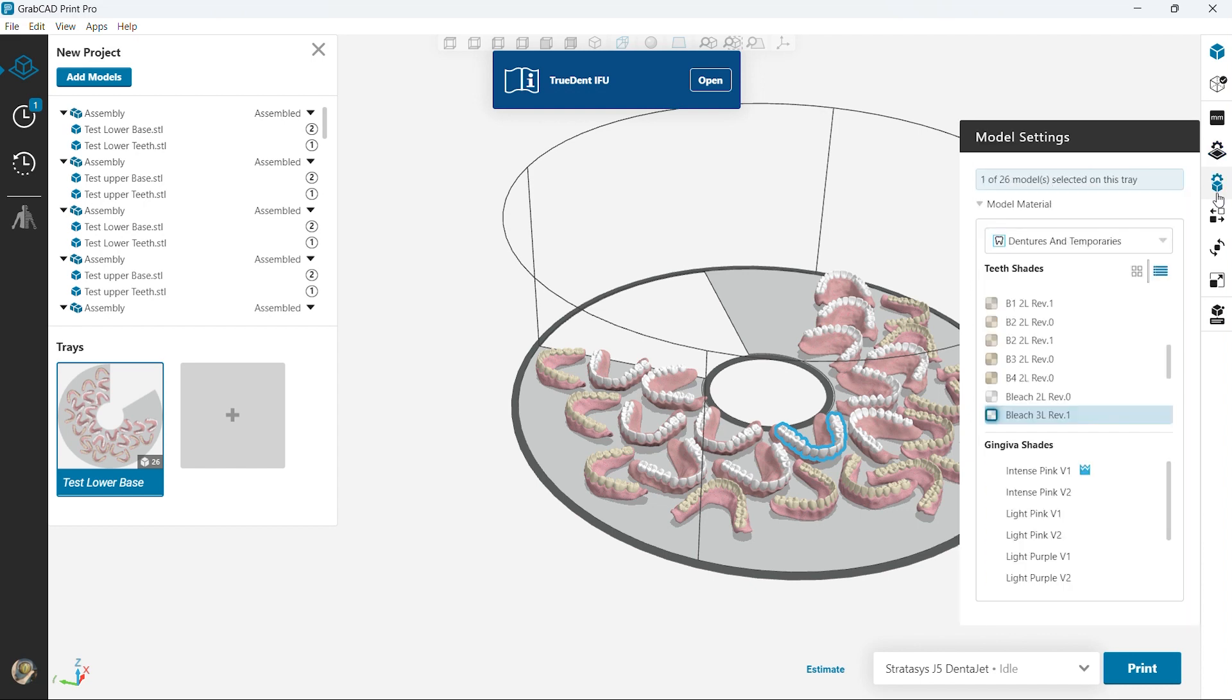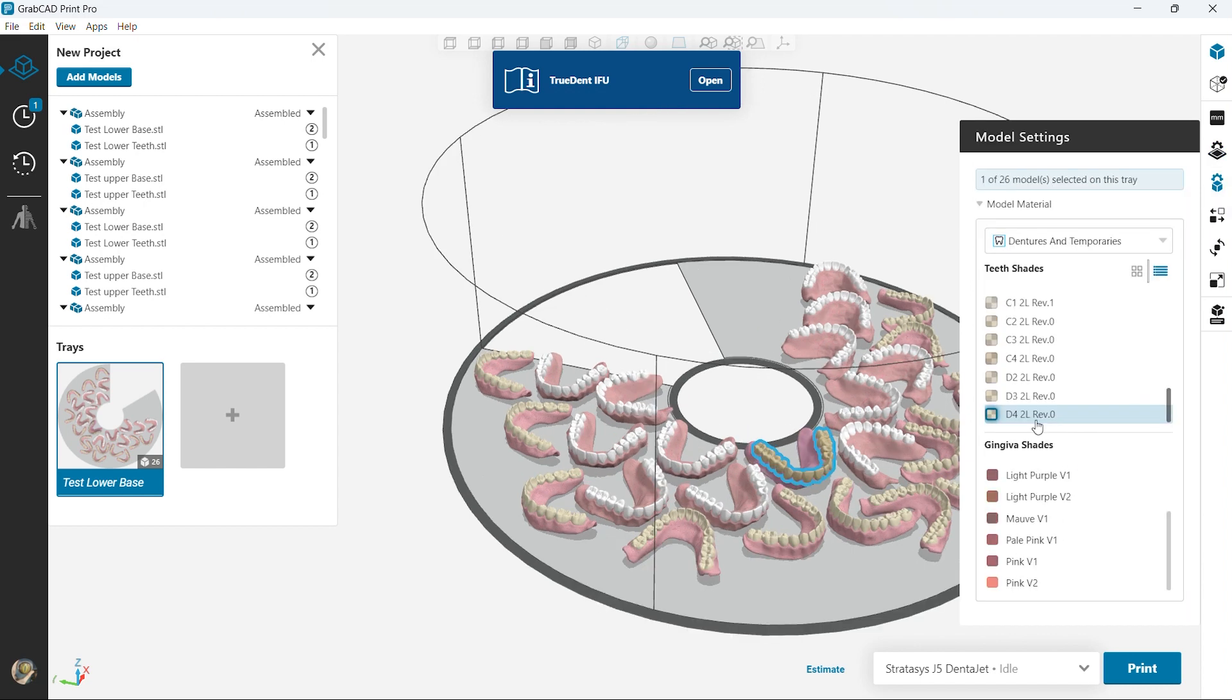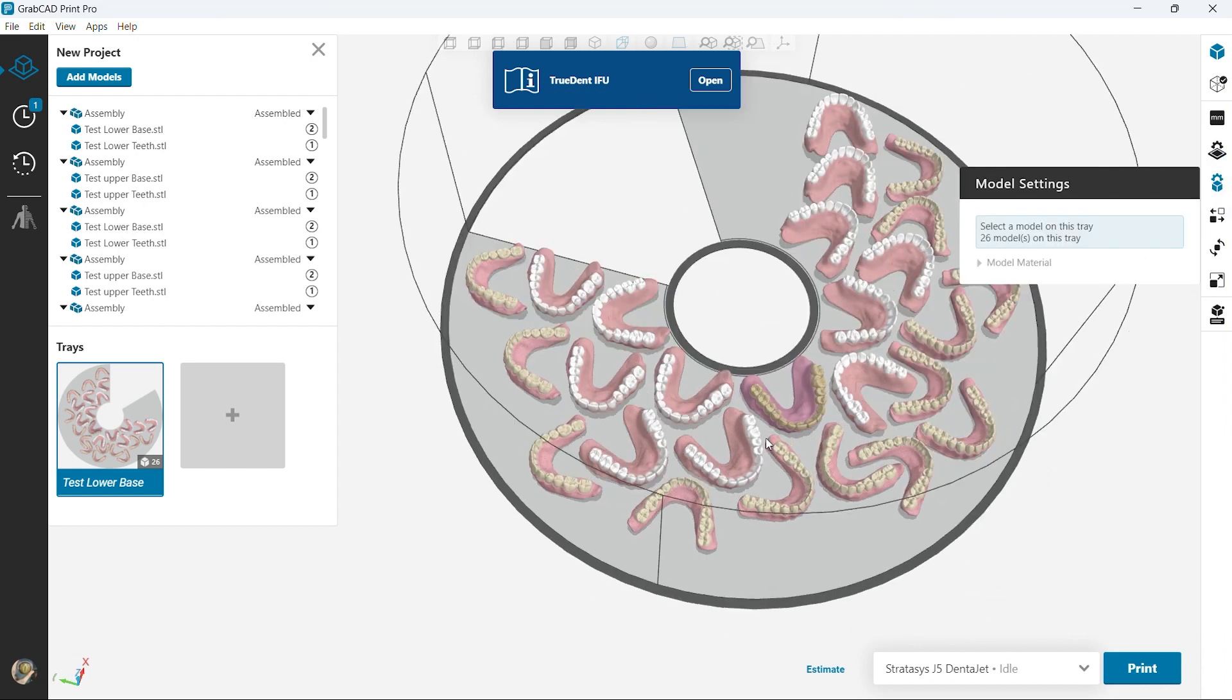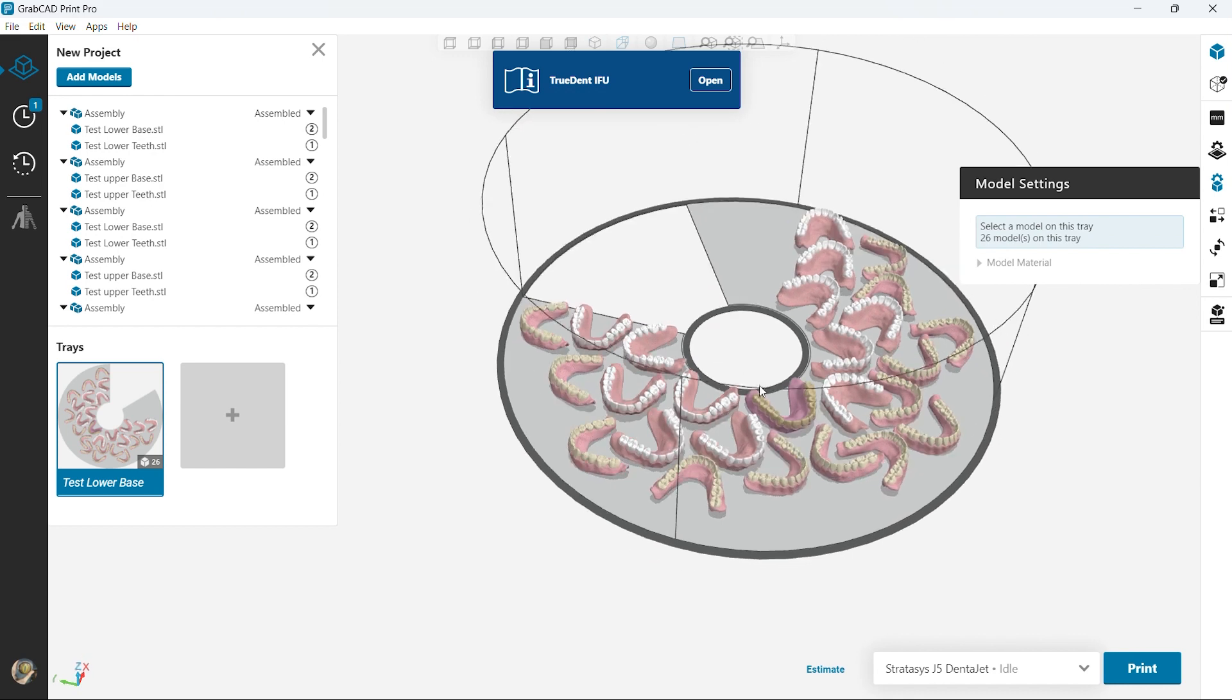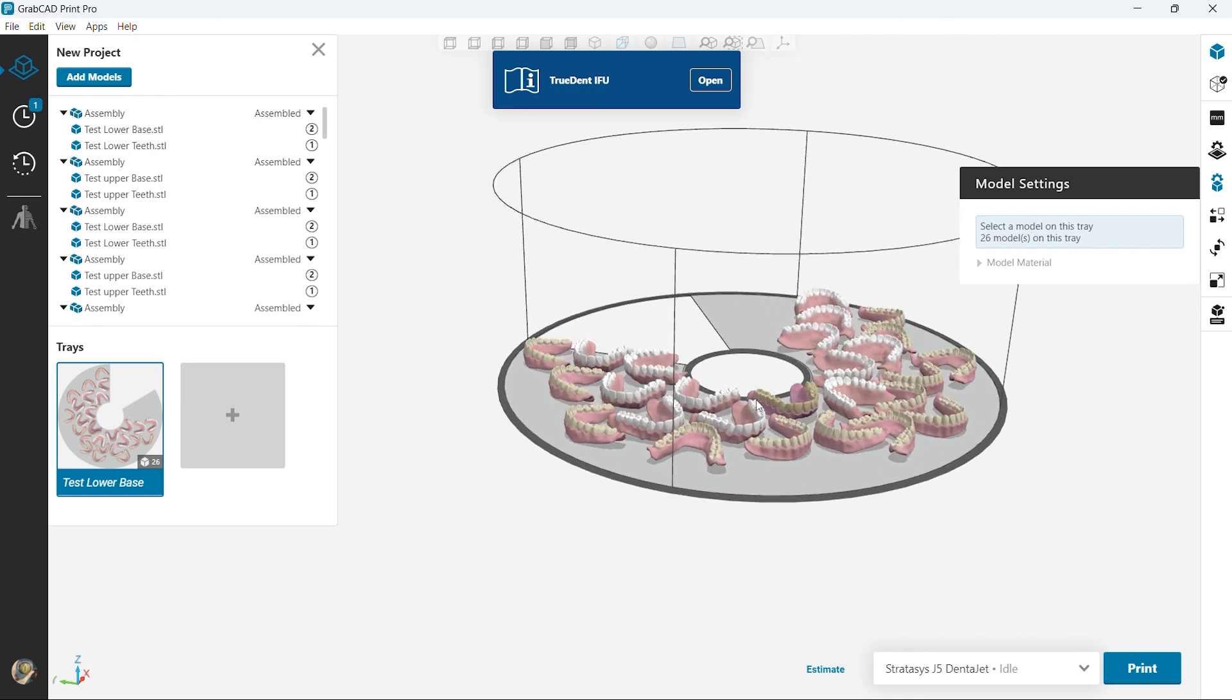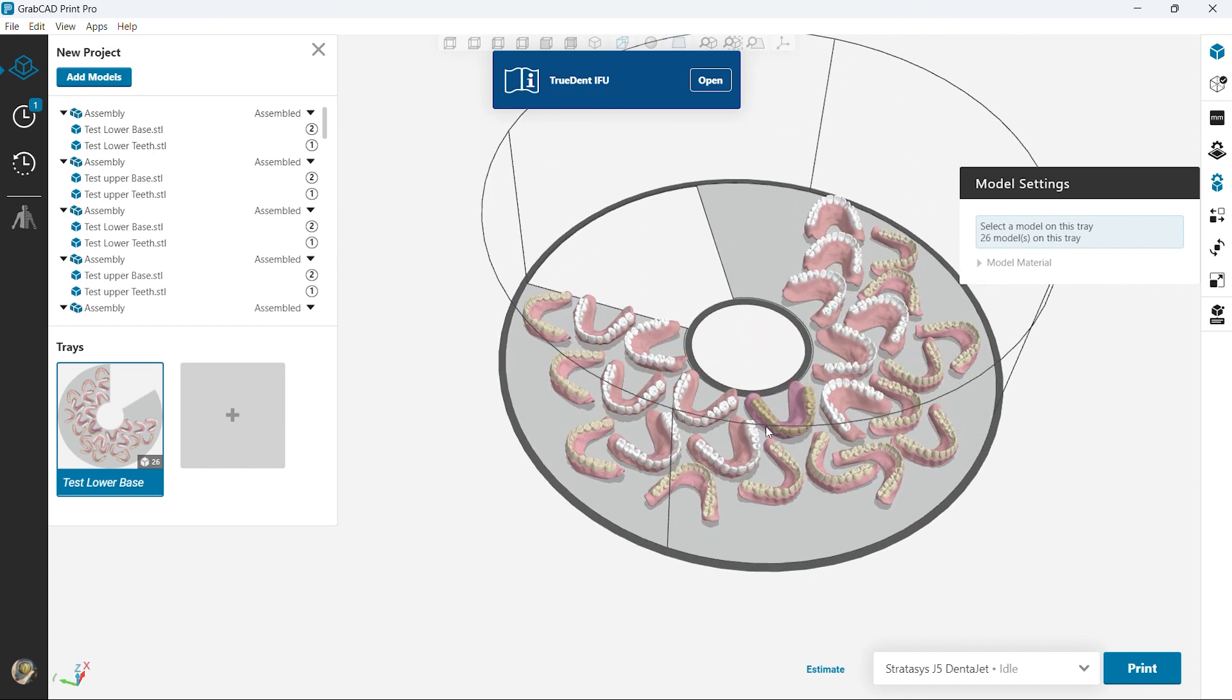Shown here you can individually customize each part, play with the gingiva shade color, the teeth color, easily and quickly.